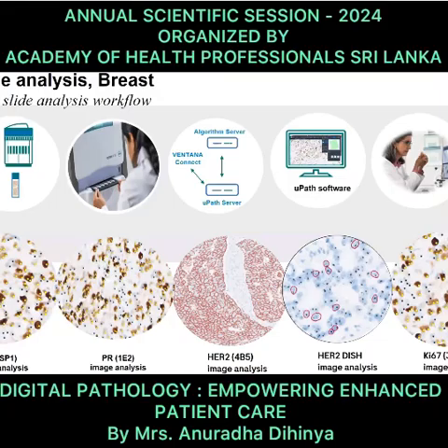Because when you go ahead with CE-IVD approved algorithms, you need to go through a validation process, and in that process the pathologist needs to be confident that they are reporting with confidence using the IVD approved algorithms. In the market, you will also find algorithms that are research use only.